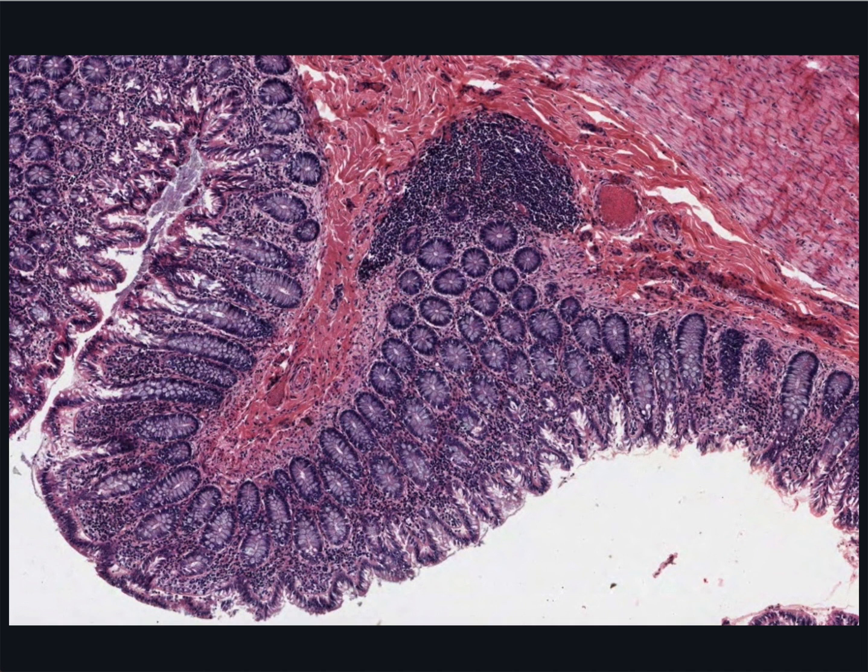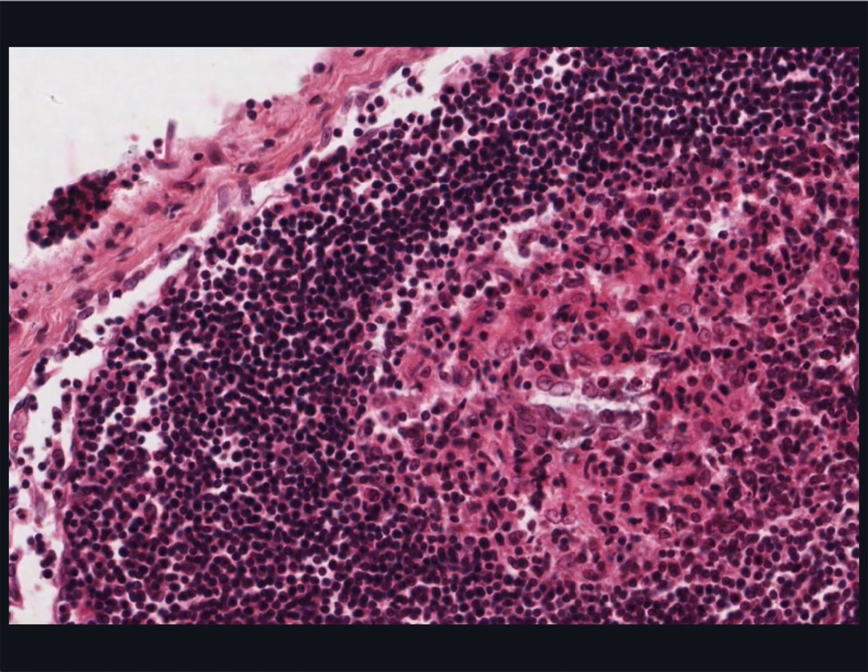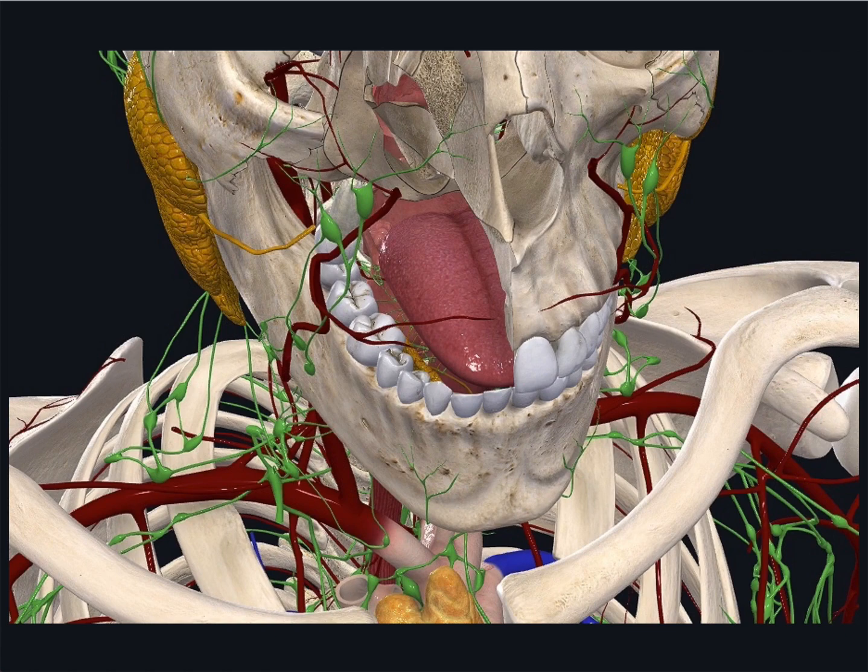But most nodules are secondary nodules, and later I'll show you their distinctive features, including a pale-stained germinal centre and a darker stained mantle zone or corona, which is the outer ring of small lymphocytes surrounding the germinal centre. Secondary lymph nodules are common in the alimentary tract and can be found in specific locations. I'll describe a typical secondary lymph nodule in my next short lecture.